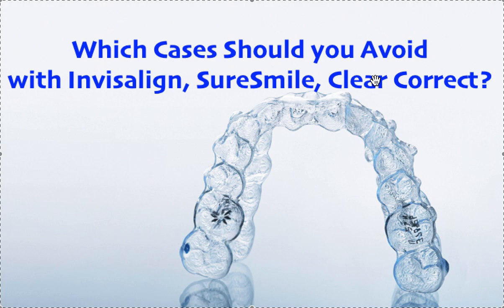Also, if you're taking Invisalign, you have to do comprehensive. If you're taking Go, it's a lot more limited. And just because they say you can do it doesn't mean it's possible. You don't know how many times... thank you so much, Invisalign, for doing a bad job of allowing doctors to proceed with cases they should not be doing, and having them be unpredictable and impossible, because it gives me business. So I do really appreciate their sloppiness.